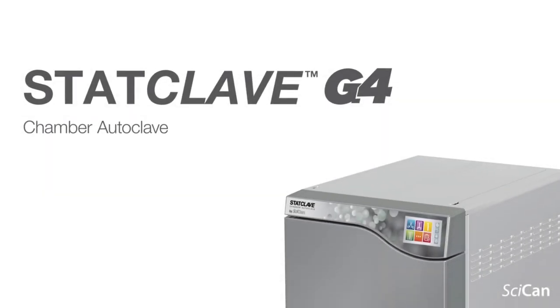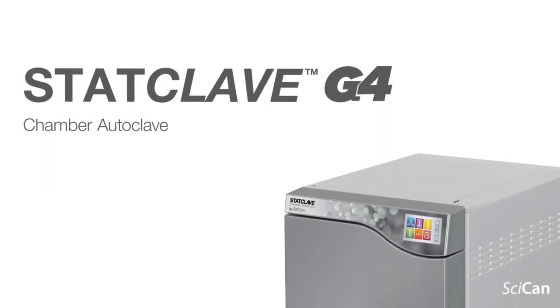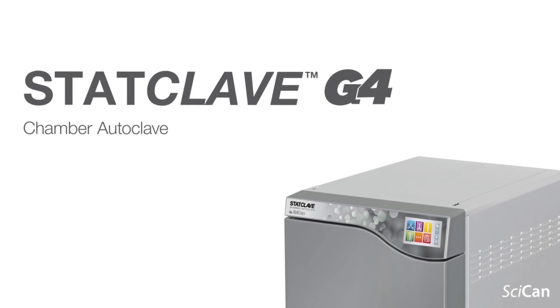Yes, I am. We are proud to launch this product yesterday at the PDC. This is a 100% Canadian manufactured product, made in our production facility in Toronto. It is a large chamber autoclave — a highly sophisticated autoclave because infection control policies in Canada are constantly evolving. So what we've done is developed a platform that will evolve along with those regulations.